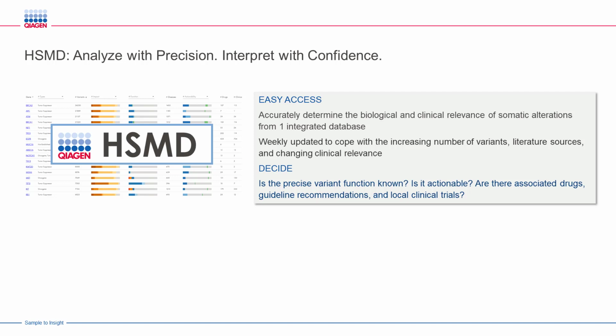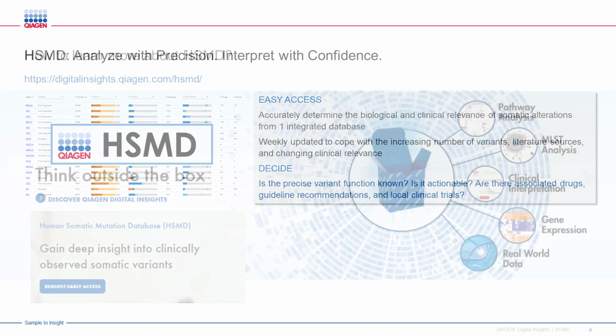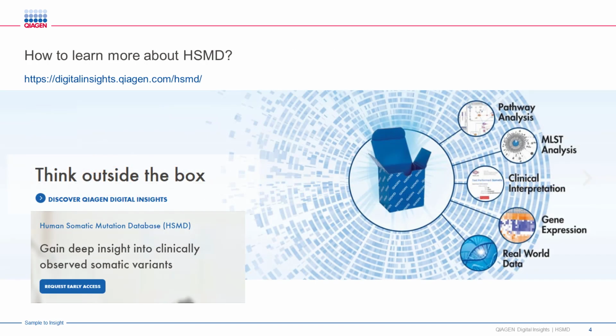Whether you're trying to determine if a variant you identified is indeed novel, educate yourself on what is published about a specific gene as you work on your manuscript, or design an experiment using that perfect experimental design, HSMD is going to allow you to know more in less time and with less effort.